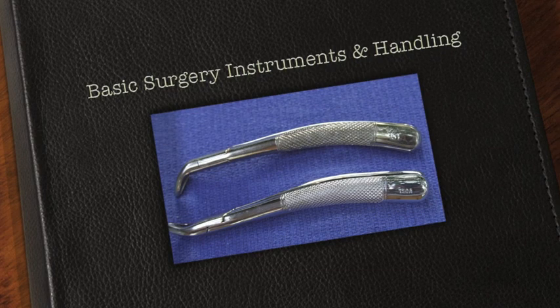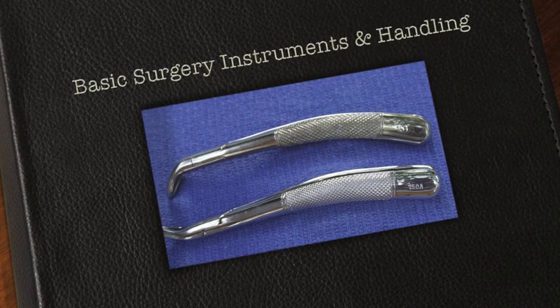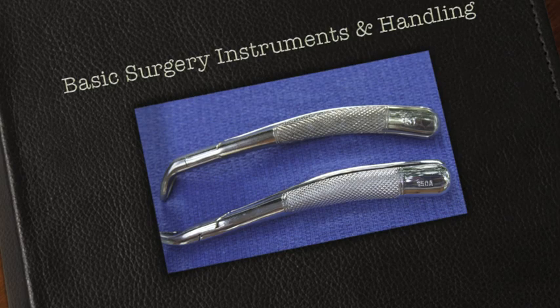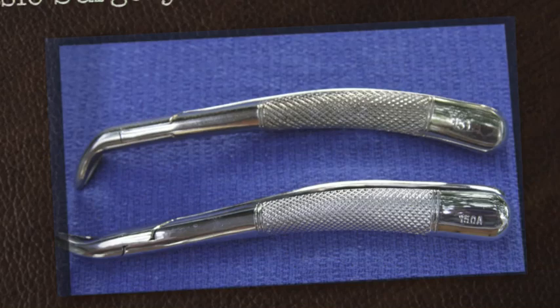As far as handling the instruments, we will show you the most typical way to handle surgical instruments as you pass them to the surgeon. Also, surgeons that are trained in different places will have different ways of doing things. And if that be the case, take the lead from the surgeon and pass the instruments to them the way that they request.